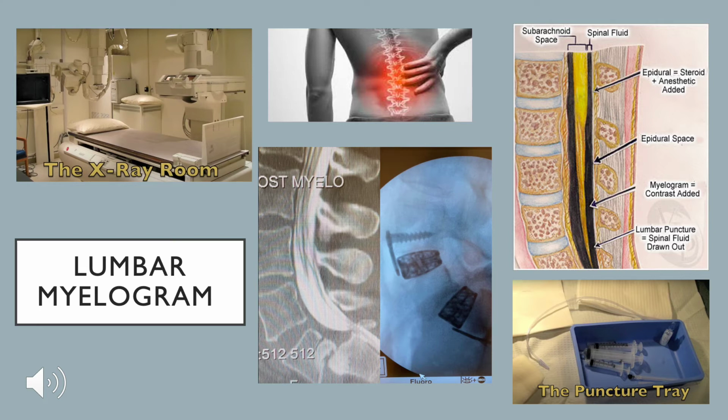Day of the procedure. Patients should be on an empty stomach for roughly 3 to 4 hours, depending on the radiologist group and/or at the facility's discretion. Myelograms are performed in the X-ray room by a radiologist, who is assisted by a radiologic technologist at times, to maintain a sterile environment.